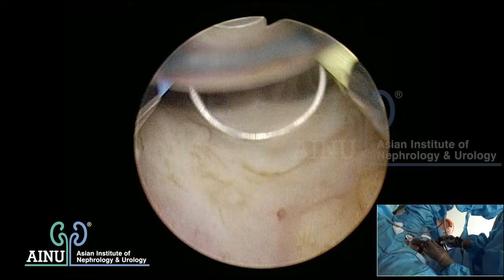This is the verumontanum and a small tissue in front of it - keep the verumontanum intact and expose that tissue. There will be significant bleeders around the verumontanum, sometimes tenacious and not settling easily. But majority of these bleeders don't really trouble you postoperatively - most will close down the moment you put a catheter. These are mucosal bleeders mostly.